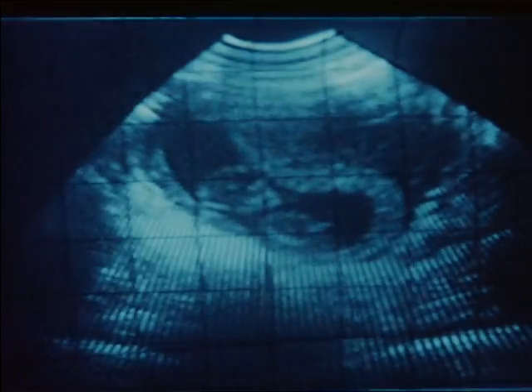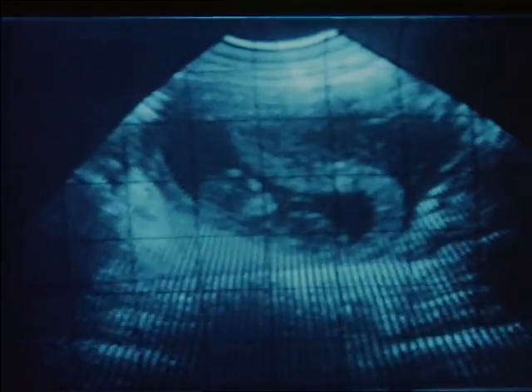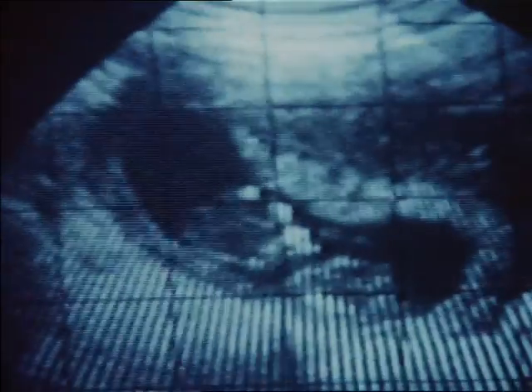Ultrasound pictures are created using pulses of very high frequency sound, pulses like these seen with the help of a laser. If a barrier is placed in the sound's path, part of the pulse is reflected. These reflections can be used to build up an image. It's an advanced form of this technique that allows us to picture the restless activity of an unborn child. And now the same method is being used in a totally different way to look for disease at the Royal Marsden Hospital.